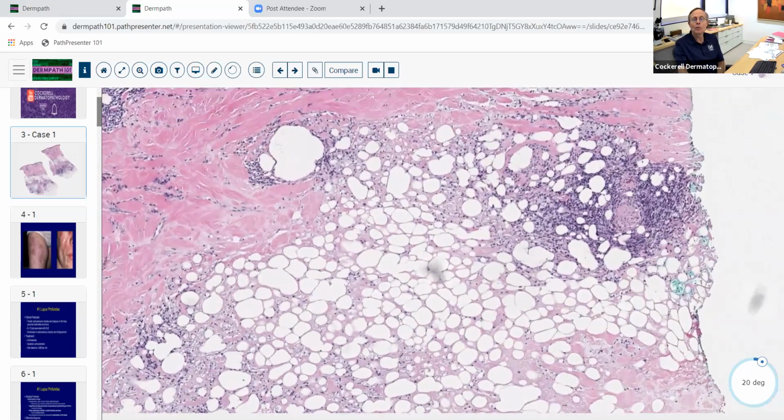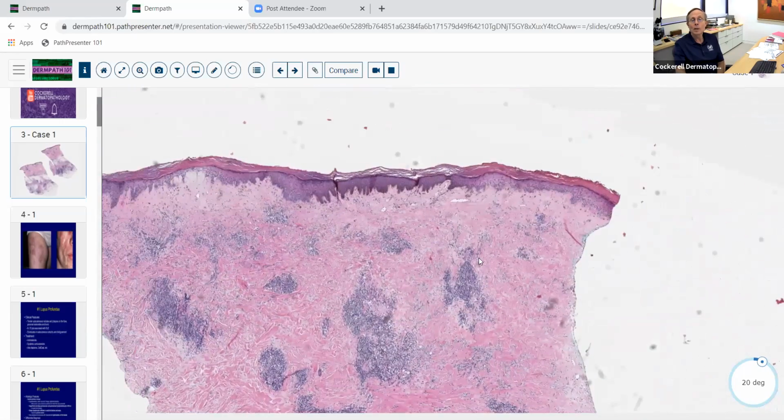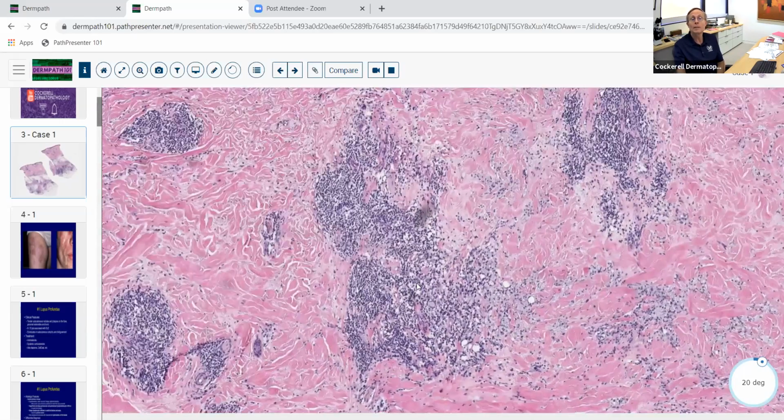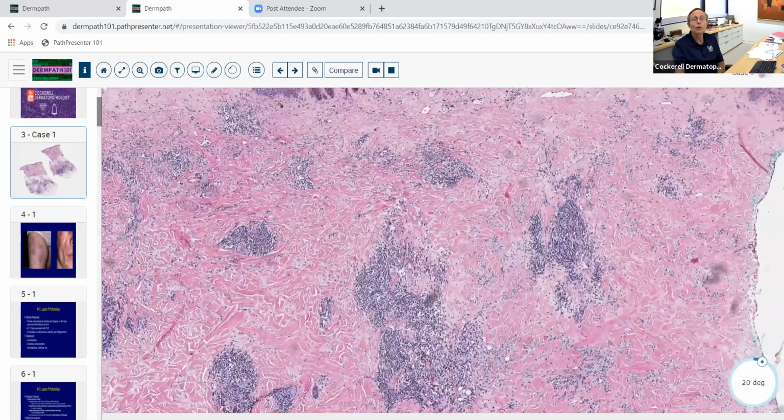And then if you look at the overlying dermis, there's also an inflammatory infiltrate up here in the dermis. You've got the lymphocytic infiltrate of the dermis with some mucin, which is what we would see if we were to do a superficial biopsy, not even get down to the fat. That would look more like garden variety lupus erythematosus, like a lymphocytic infiltrate of tumid LE.